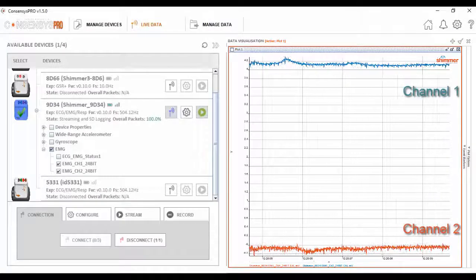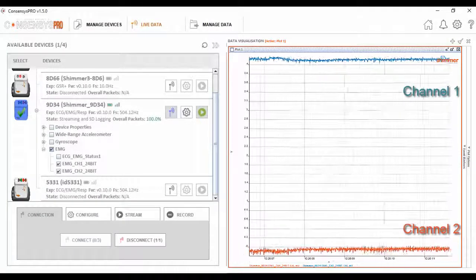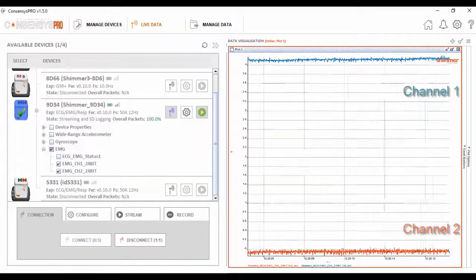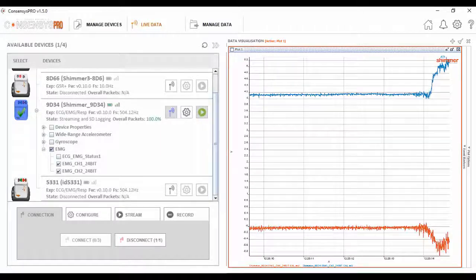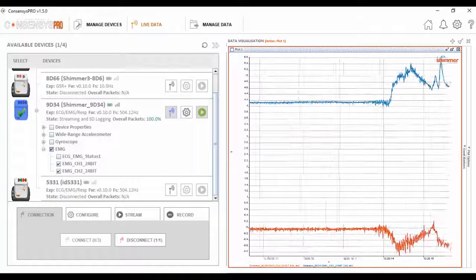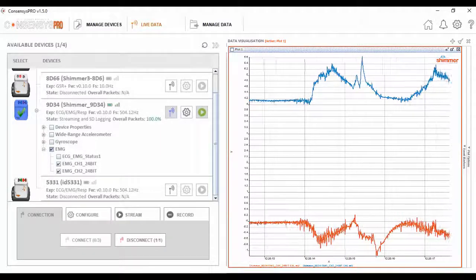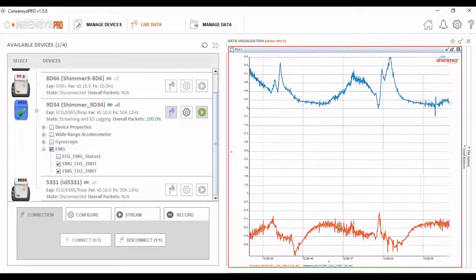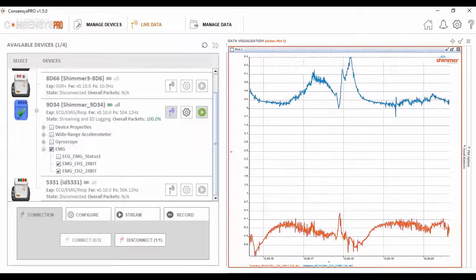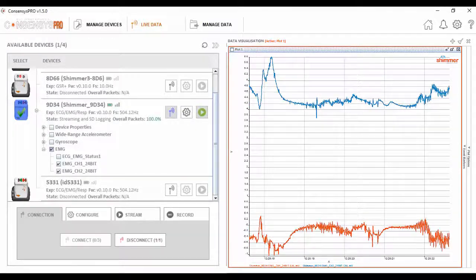Let's have a closer look at the data visualization. Channel 1 is the bicep muscle. I'll now perform some bicep exercises. While channel 2 is the brachioradialis muscle, I'll flex this now.